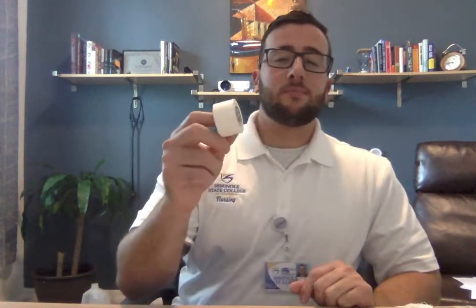So I'm going to have my 1 ml syringe. I am going to have my 23 gauge needle. I'm going to have my influenza vaccine vial. I'm going to have my tape so I can label my vial and my syringe. And then I have my gauze and my alcohol pad here. Here I have my clean gloves. And then I also have my syringe box here.